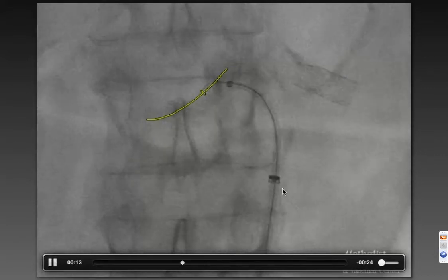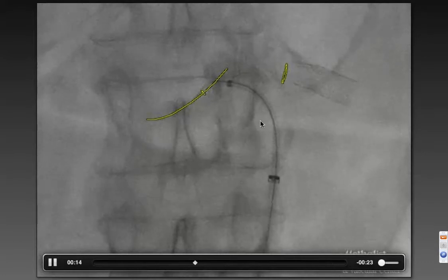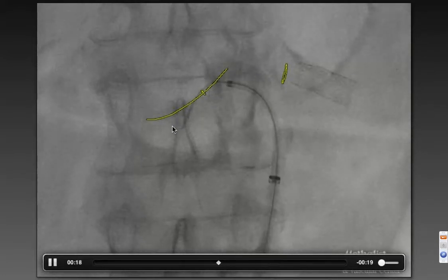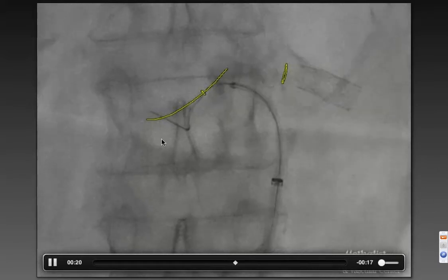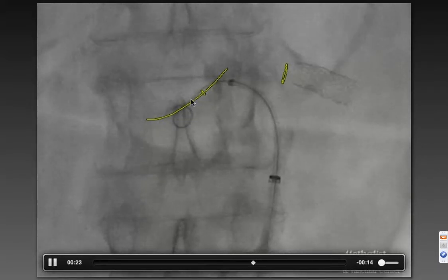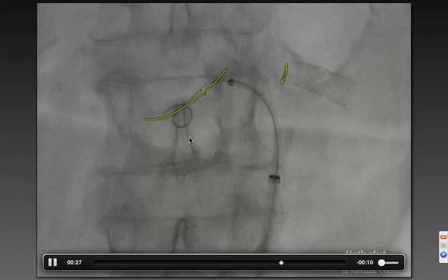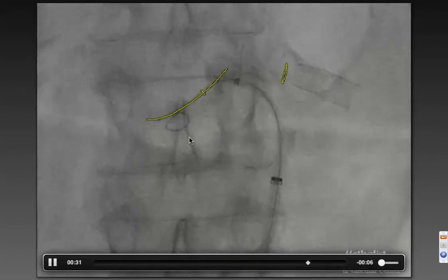We got the nine French sheath, got the catheter up, and believe it or not, this was the first attempt at wiring this — you can imagine there were oohs and ahs. There were also some oohs and ahs when the wire looped up in the renal artery, but at that point we had spent so long trying to get a wire in there that we weren't taking it out or trying to straighten it.